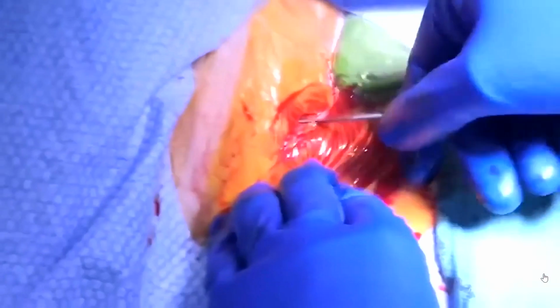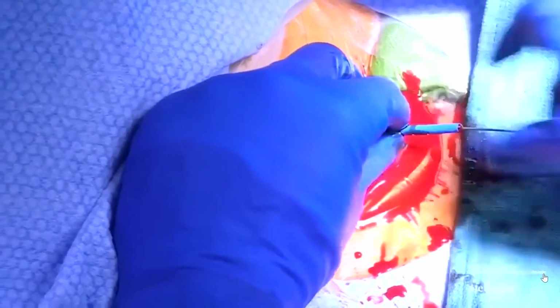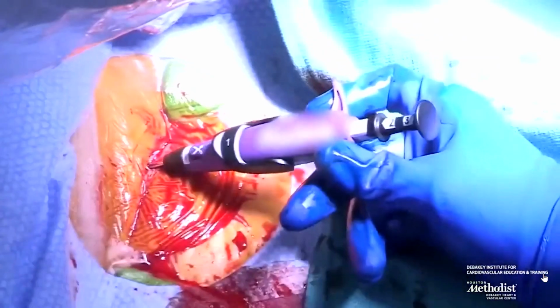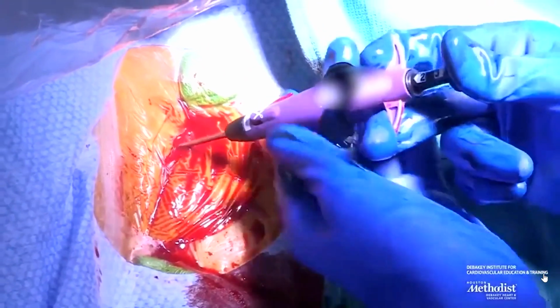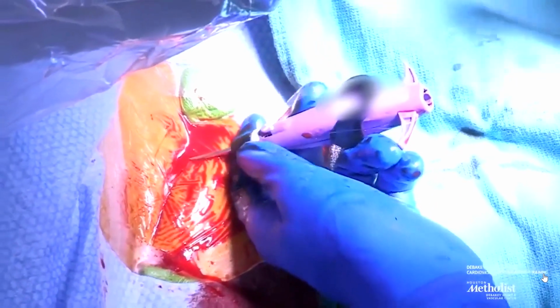We place a wire up through the mini stick, and we follow it with X-ray machine, and then we upsize by placing a J wire, which you're going to see there introduced into the sheath of the mini stick wire. And then we use these two devices called the ProGlides. These devices allow us to place a suture inside the arteriotomy. We used to place 2 traditionally. Now, for most cases, we do 1.